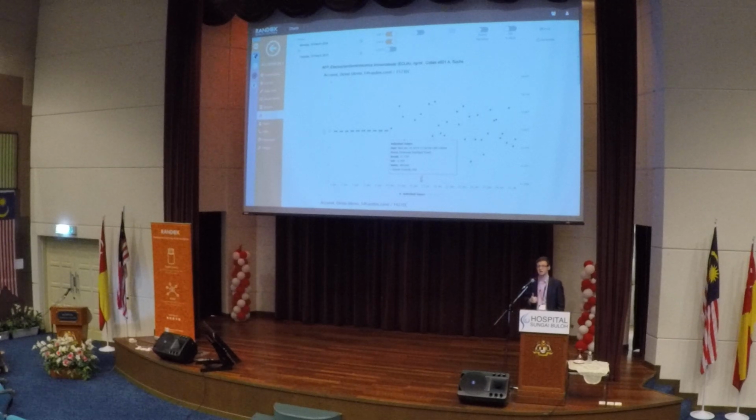If we have any rejected results, those will be highlighted in red. A red result then just means we need to investigate straight away. That's definitely an error.